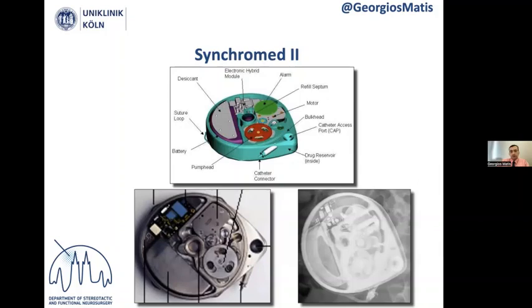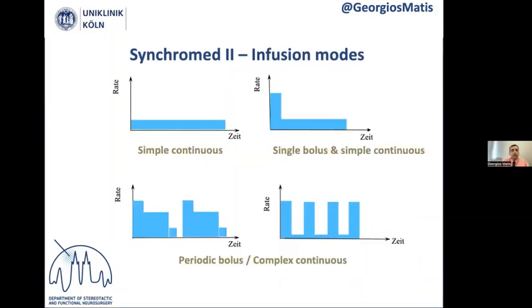There is a battery inside, and this is why every 6 to 7 years we have to change the pump because the battery is empty. And which is the advantage of such a pump? The advantage is that we can have different infusion modes.